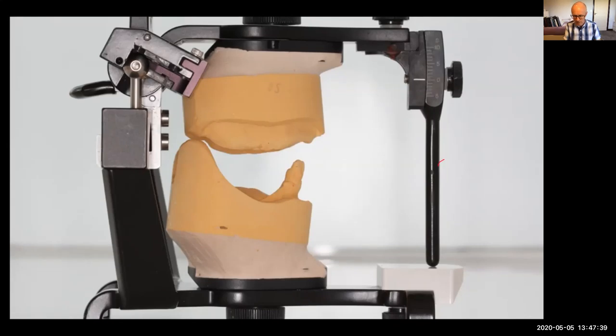If you look at fixed upper all-on-6 or all-on-4 type arrangements, the patients often just look too toothy. There's too much tooth show, and it's purely because of a lack of inter-arch space. So this lady has what's called combination syndrome. We've got the over-eruption of these lower anterior teeth bashing into this maxilla here as well. But I do find that the tuberosities just get bigger and bigger over time as well.